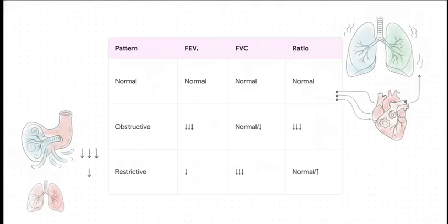This right here, this is the mechanical heart of spirometry. Notice how obstruction practically guarantees a low ratio, simply because you can't get air out fast. But with restriction, it's a totally different story. Because both the FEV1 and the FVC drop proportionally, meaning you have less air overall, but the tubes themselves aren't actually blocked, the ratio magically stays preserved. Sometimes it even goes slightly high.